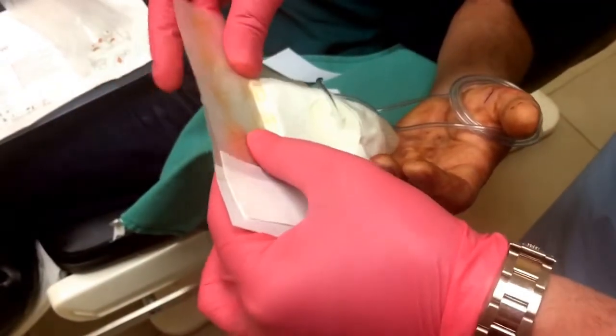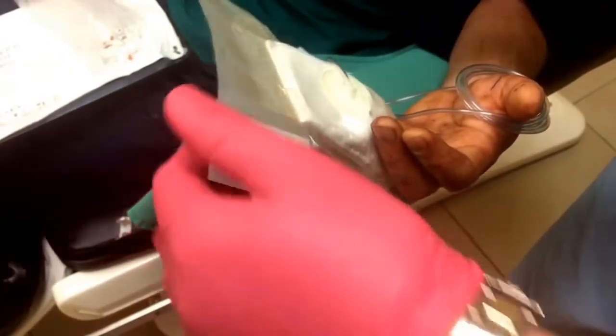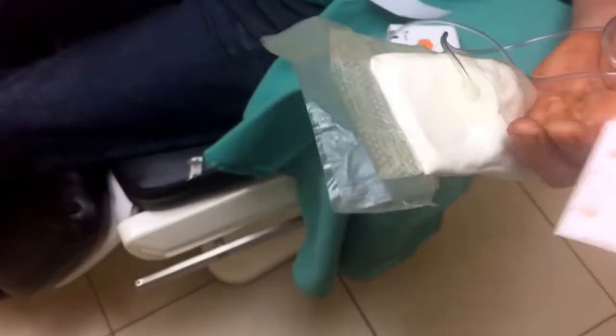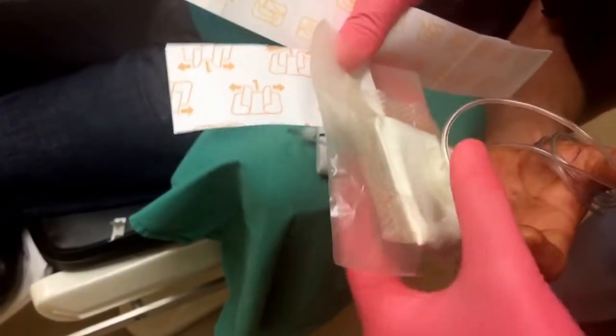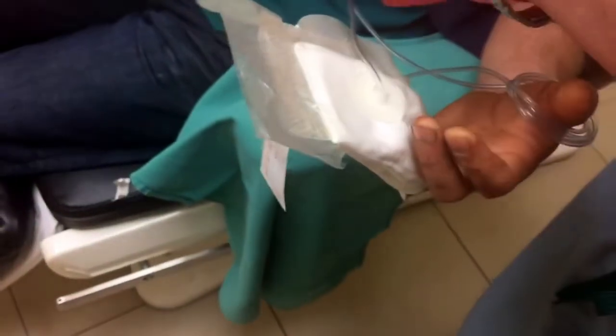We're far enough away from this — his finger is down here. So when I'm squeezing, I'm not hurting him. And then what you do is you very gently peel off number two, just like that. So now it's sealed on the top. And then when you repeat the same thing on the long ways, I tend to use the whole piece. It's the same technique — you take off the one that says one and overlap it about 50%.